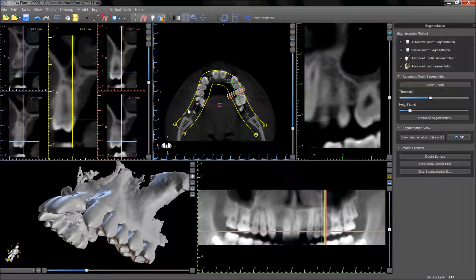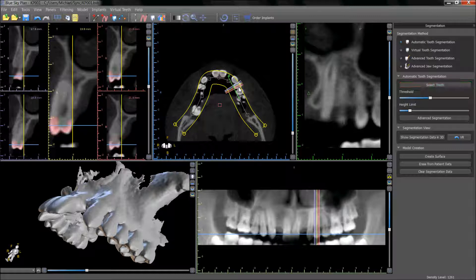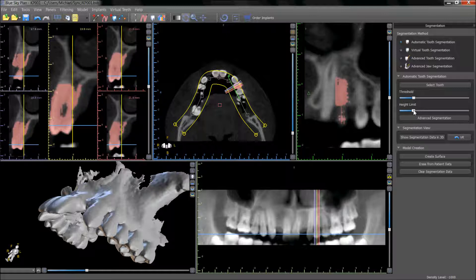The axial slice view should be positioned towards the edge of the relevant teeth. Automatic tooth segmentation is the fastest way to segment a tooth. Pressing select tooth and then the relevant tooth will highlight the tooth in pink. The threshold slider can be used to raise or lower the density threshold to affect the area being selected in pink. The height limit can also be used to control the length of the area being selected.